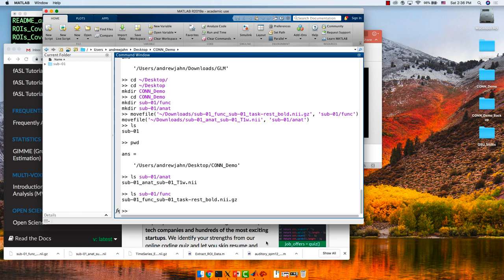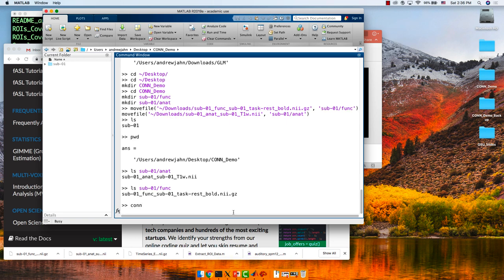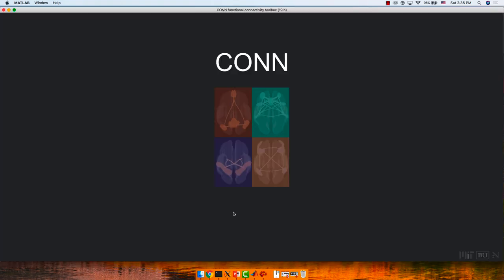We're going to take a brief tour, do some preprocessing, and while the preprocessing is going I'll tell you exactly what preprocessing does and why. Type 'conn' and press Enter.